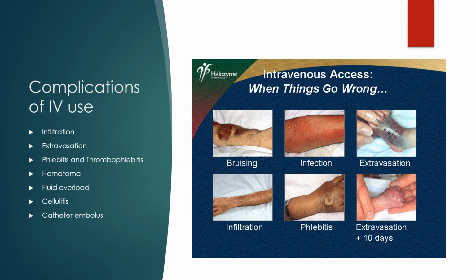Hematoma is the next one. Hematomas most commonly occur when you're placing the IV. So let's say I place the IV, it goes in, it looks great. But then when I'm placing the tape, I wiggle it just a little bit and it nicks the other side of the vein, or I go all the way through the vein. When that occurs, the blood leaks from the area into the surrounding tissue and it essentially makes a bruise. That's your hematoma. So what can we do for that?